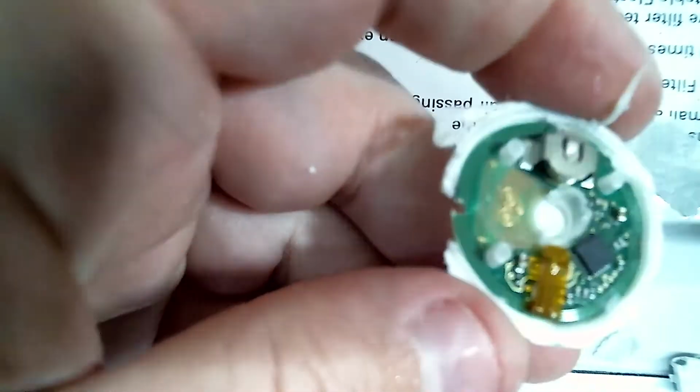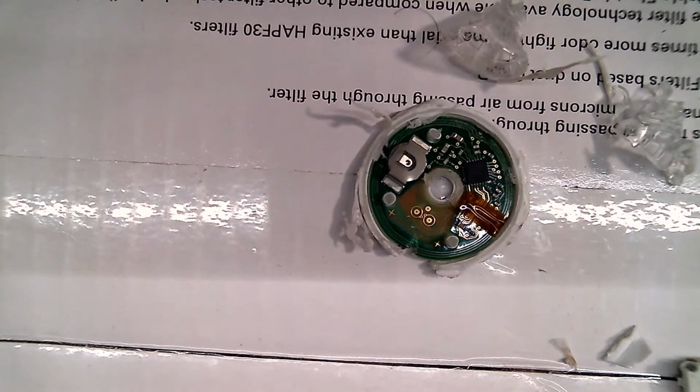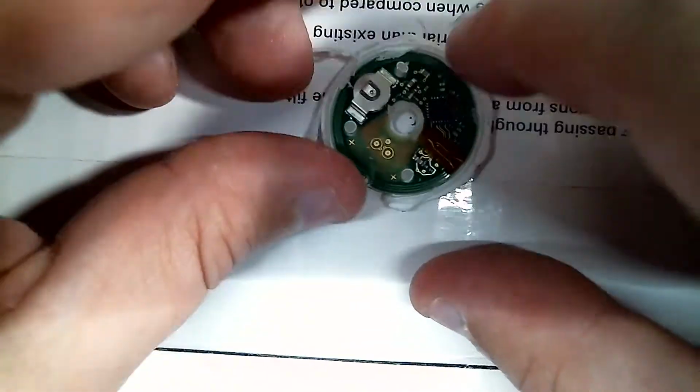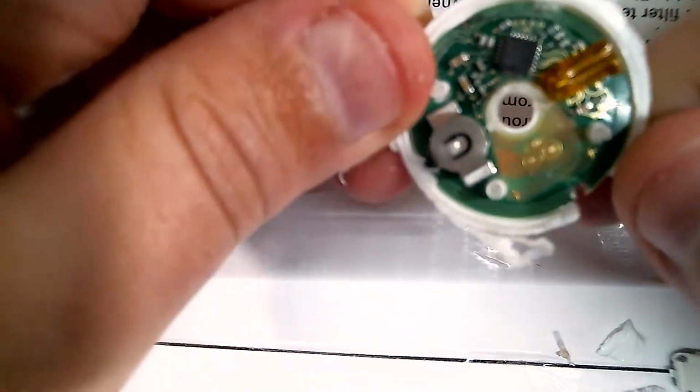Glued in the core, too. Oh, okay. That's the last little bit, I think. Hopefully, if I can pull this. Oh, hey, there's a chip. Definitely a chip. Okay, we're in. All right, so what is this thing? All right, I don't know if we're going to be able to read the chip, but we'll try. And it's probably completely proprietary. But, so there's a little bit more in here than I thought.